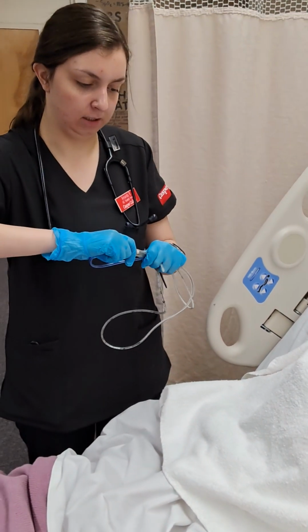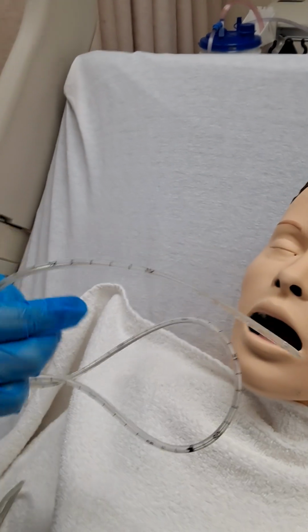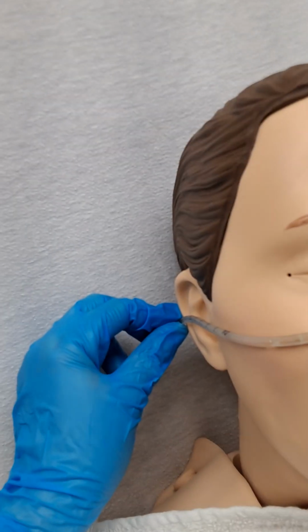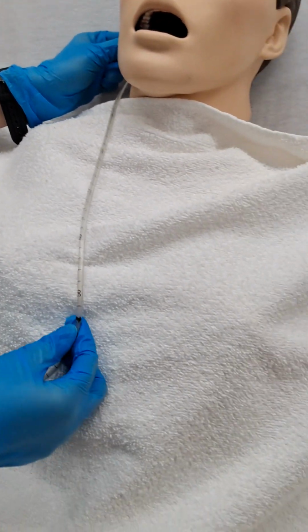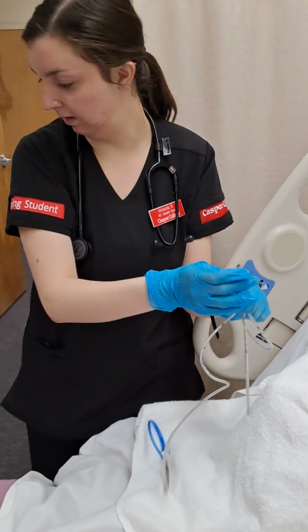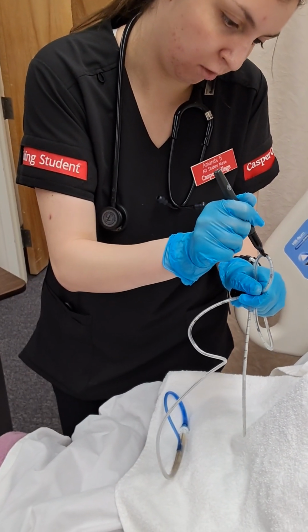Now I'm going to measure it. So I'm measuring it from the tip of the nose to the end of the ear, and then down towards the xiphoid process. So I see it's at 52. So now I'm going to mark it at the 52 centimeter mark with my permanent marker.